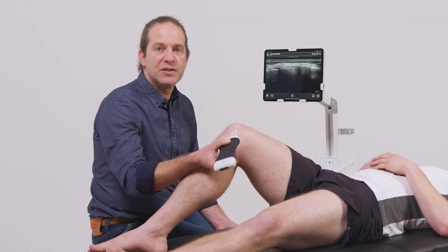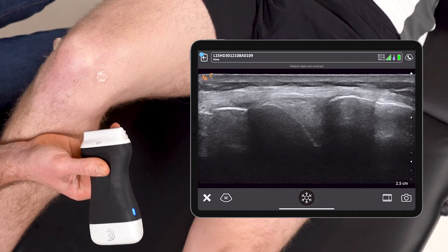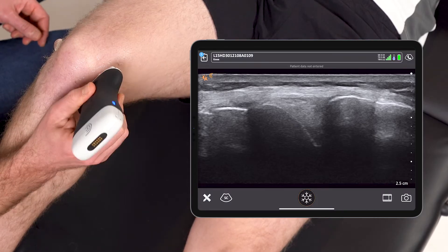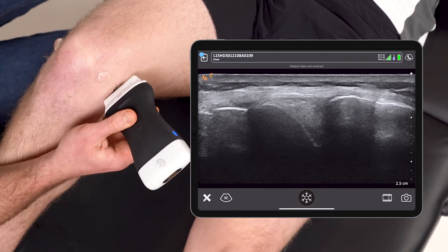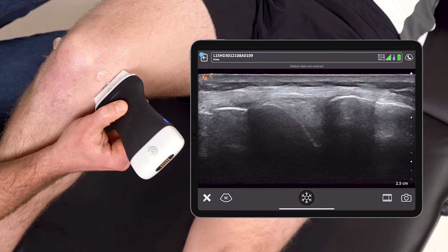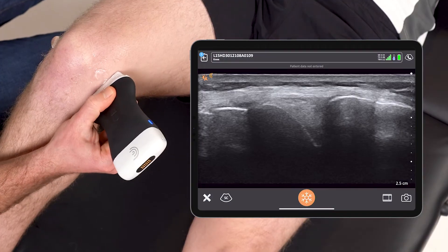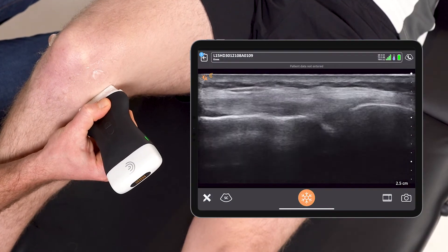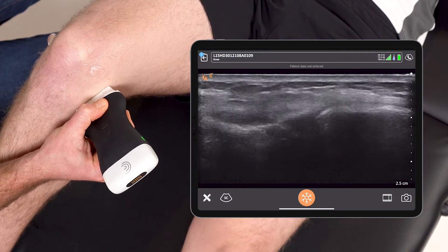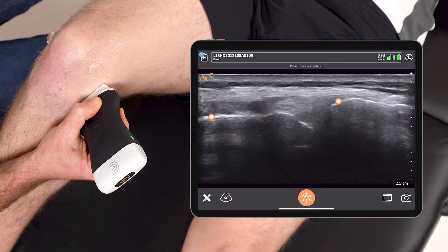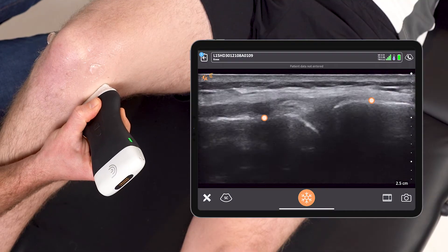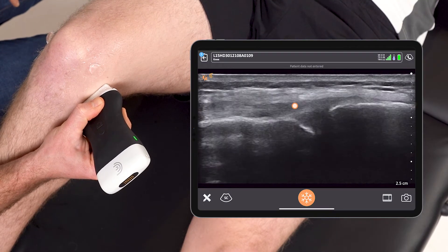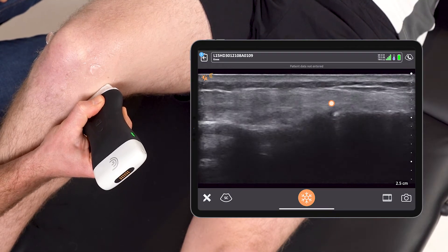I'm using the L15 scanner here on a knee preset and I'll first place the scanner on the medial aspect of the joint, identifying here the femur and the tibia, and in the near screen is my medial collateral ligament.